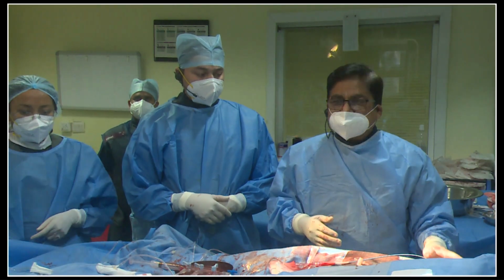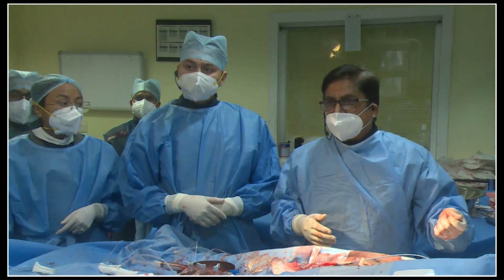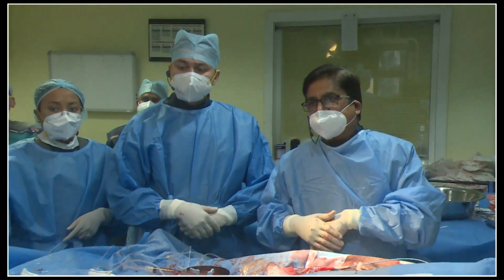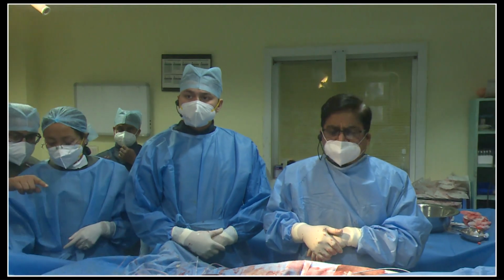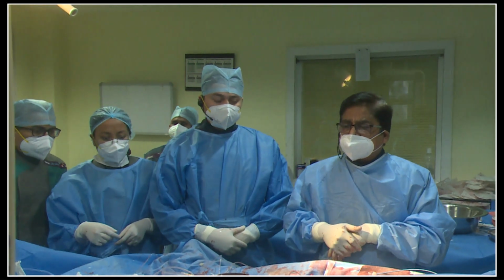And this has gone through the right radial. You use a glide sheath. You can use 7 French guiding catheters. It's a 6x7 glide sheath with a 6 outer diameter. Inside it takes 7 French. And for contralateral we have the left, which is a 7 French left EBU, which is there through the groin.